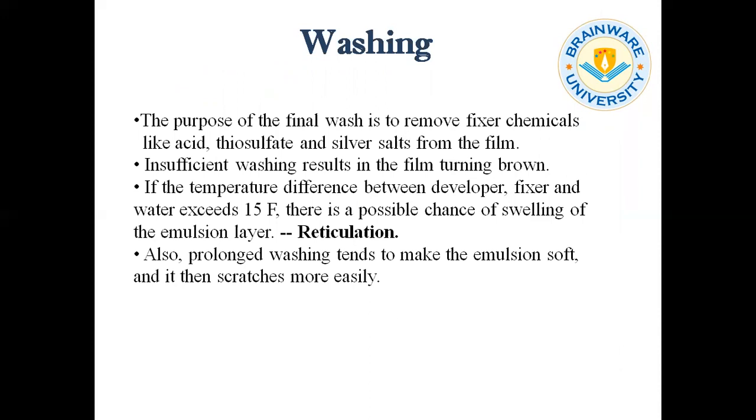Next stage is washing. It is important to remove the fixer chemicals like acid, thiosulfate, and silver salt from the film. Insufficient washing will make the film brown in color.